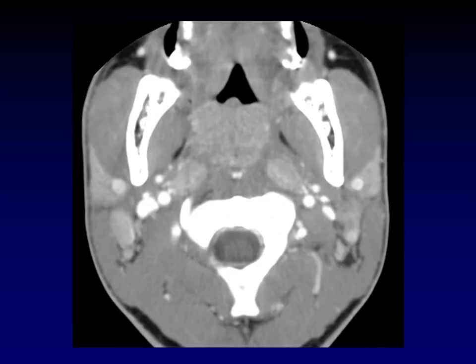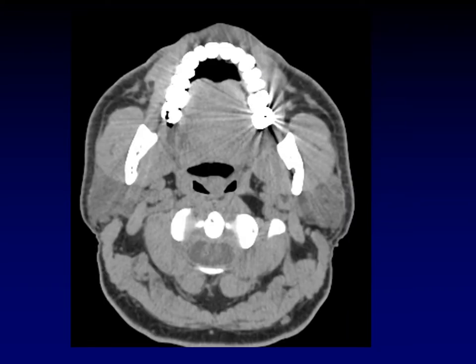Another way to get enlarged lymph nodes in the retropharyngeal space is reactive lymphadenopathy. This is a child with acute tonsillitis, and you can see reactive enlarged lymph nodes in the retropharyngeal space bilaterally, pushing the parapharyngeal fat predominantly anteriorly and a little bit laterally. And just for completeness, a lipoma arising in the retropharyngeal space — unlikely to fool anyone given its expected low density on CT, though it might be more confusing on a non-fat-suppressed post-contrast MRI.